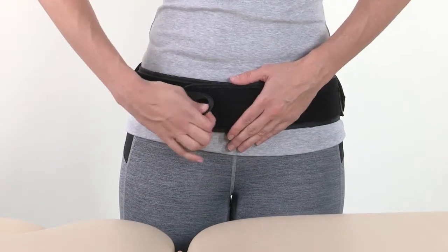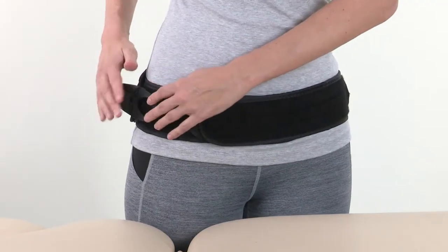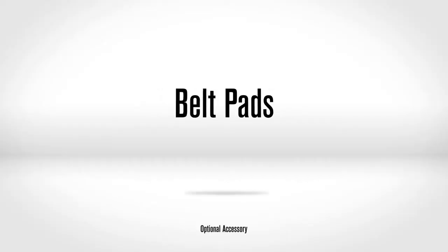Brace Removal. Detach the pull tab from the belt wings so the tension becomes loose, then reattach the pull tab on the belt wings. Detach the hook and loop connection on the belt wings and remove the belt.